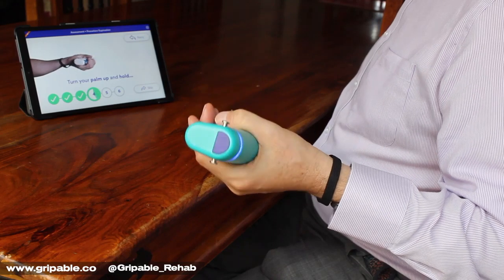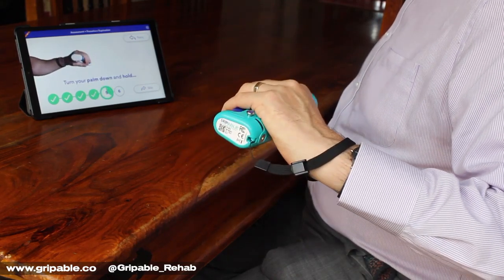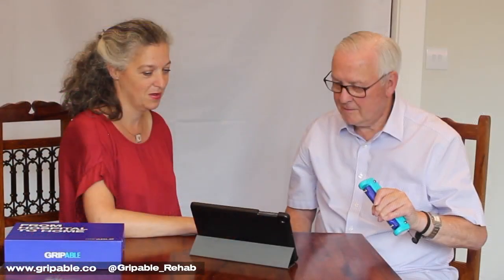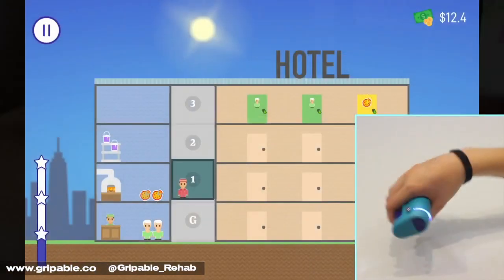The device is personalised by calibrating to your capability and you can recalibrate as often as you like. It is highly sensitive, making it appropriate for patients with significant pain or limited movement, engaging them in fun, therapeutic activities.